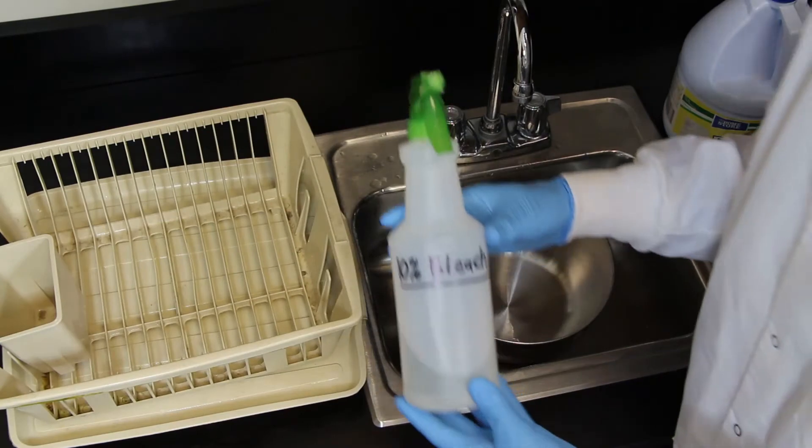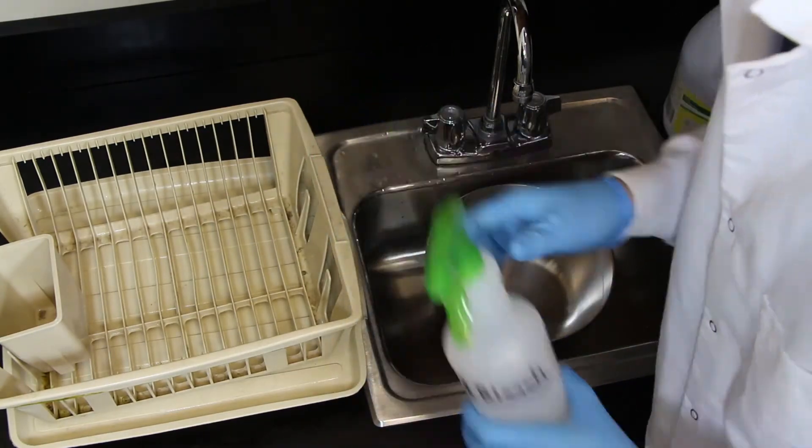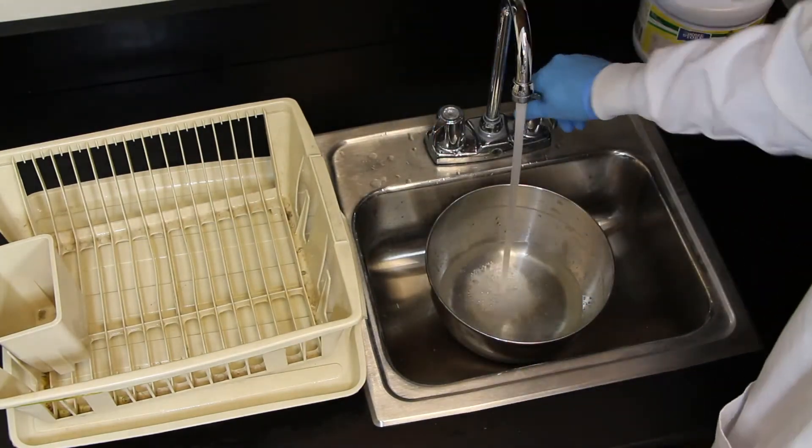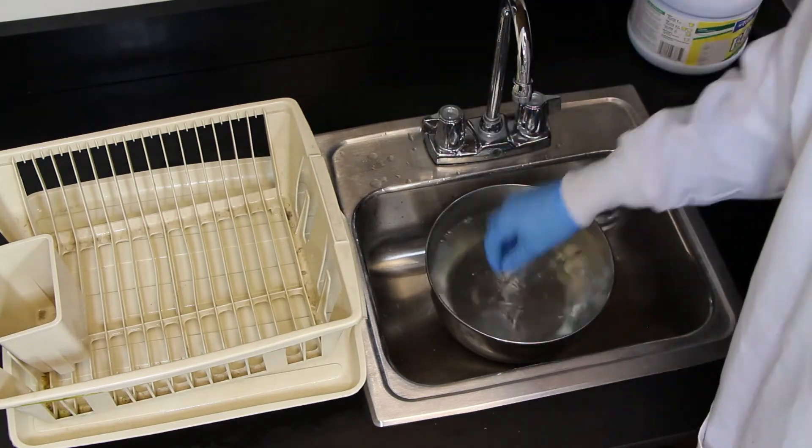That main assembly piece and that mask are then going to get soaked in a 10% bleach solution. Fill up your 10% bleach solution, put the mask and the main air piece in there, wait about 5 to 10 minutes for that to disinfect, pull it out and rinse it off real good to make sure there's no bleach residue left on those, and then just let them air dry in some sort of a drying rack.